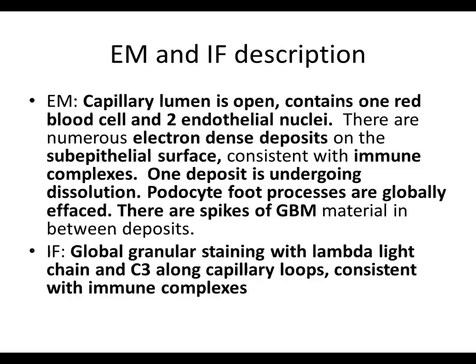Then, the EM and IF, again, Becca hit most of the important points. I think on EM you talk about electron-dense deposits, but you can interpret them as immune complexes based on their characteristics. There was one deposit that was undergoing dissolution, the electron-lucent area, which suggests that there's been a little bit of chronicity because there is some dissolution of the deposit.